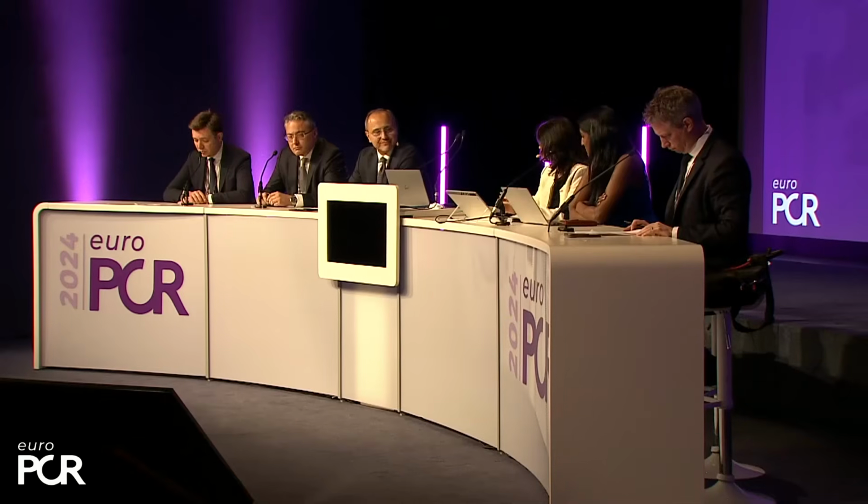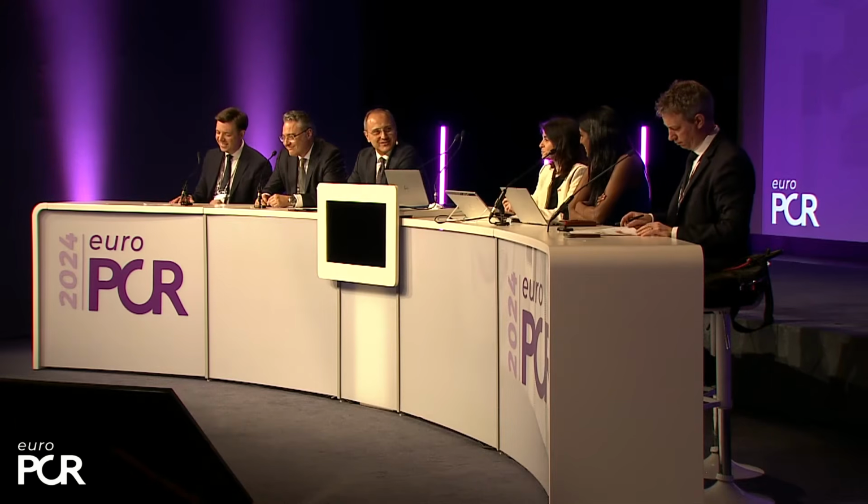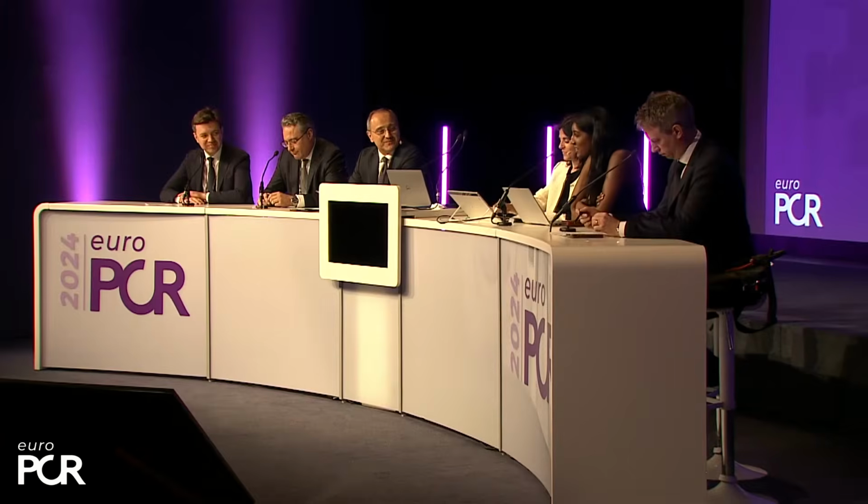So let me hear from Vani and Nieves, both experienced operators. We heard that we are not that confident that we would be able to cross. Well, first Nieves and then Vani, your tips on how to manage this? I think there are two additional problems in this patient that make it probably even more difficult. One is a post-CABG patient. We know that comes with even more calcium, and then it's a circumflex. I would say the worst combination is circumflex in a post-CABG patient. So totally agree. Tough. Yeah, very much the same.